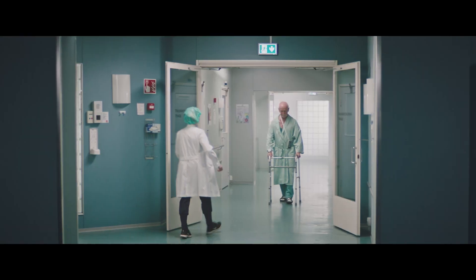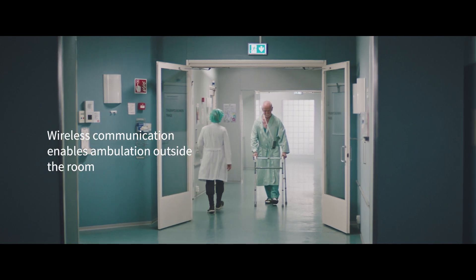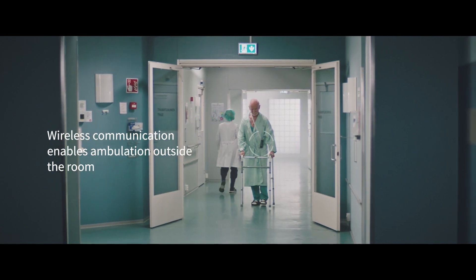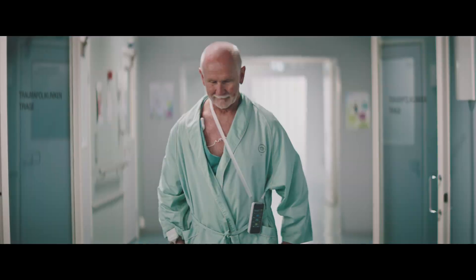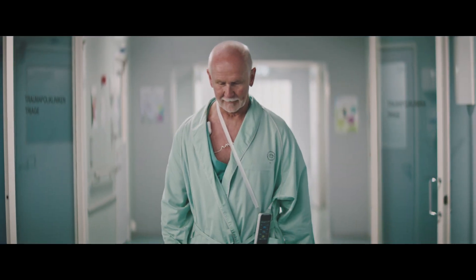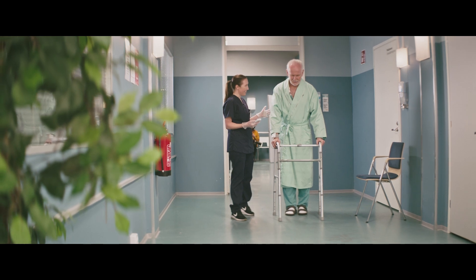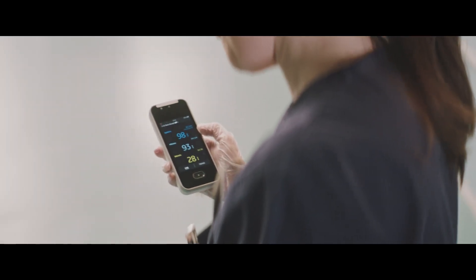When ambulating outside of the room, the Portrait Mobile patient monitor easily accompanies the patient. The monitor can be worn in a pouch, or a nurse may wish to hold onto and view the patient monitor if helping a patient.